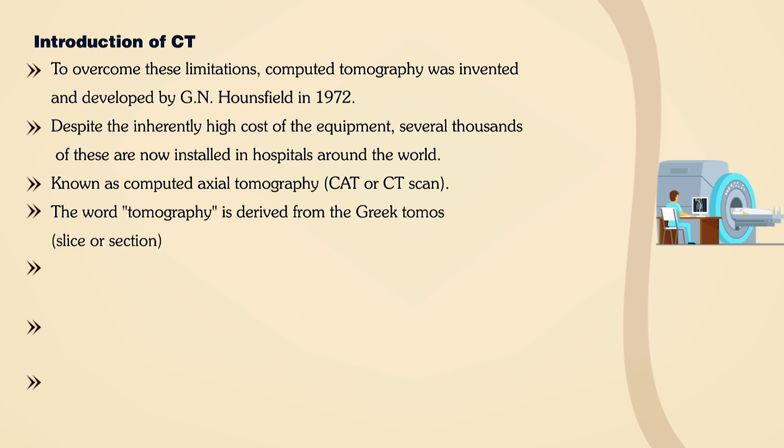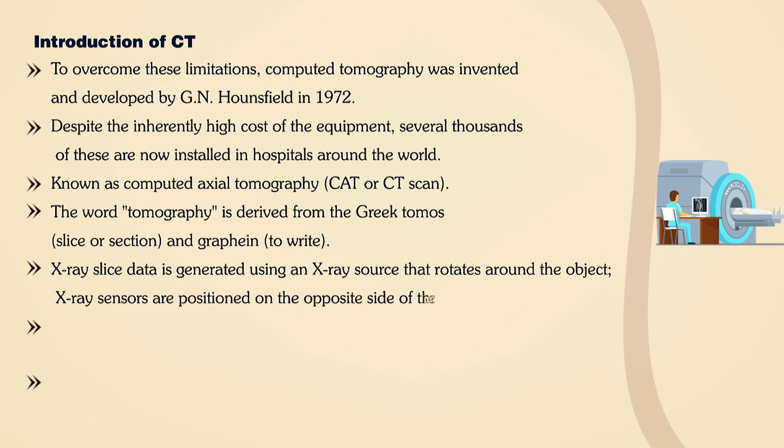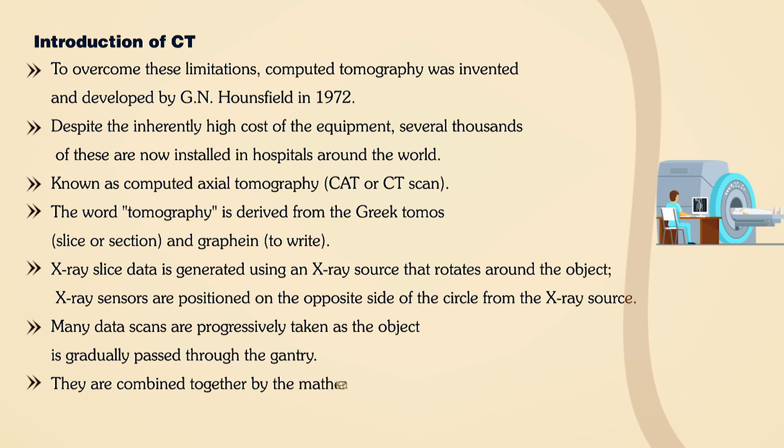The word tomography is derived from the Greek word tomos. Tomos means slice or section, and graphein means to write. So, tomogram is a record obtained by tomography, and tomography is a technique for displaying a representation of a cross section through a human body or other solid object using X-rays.